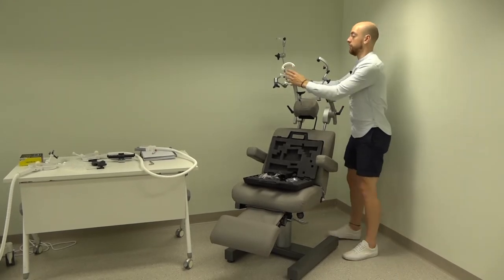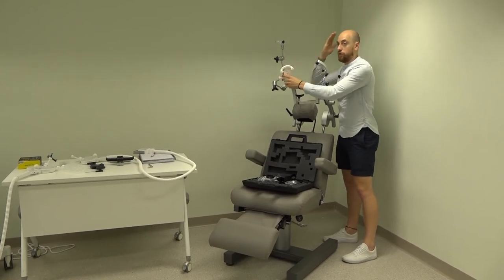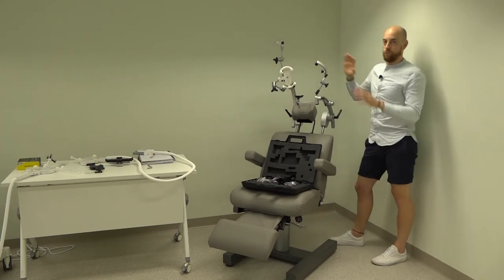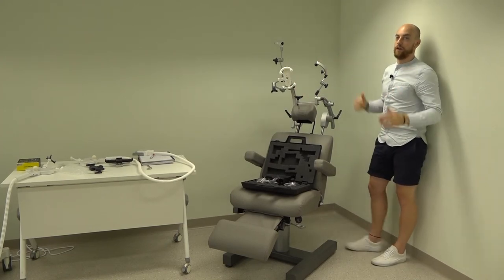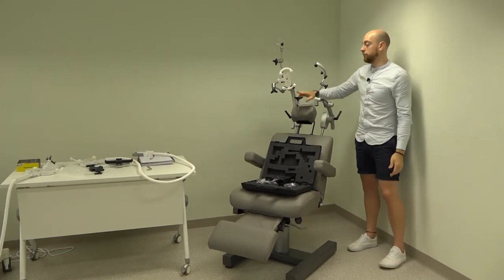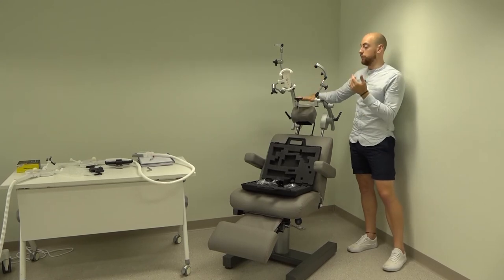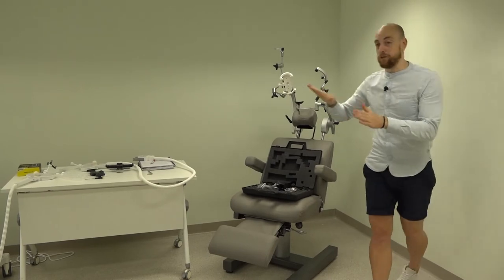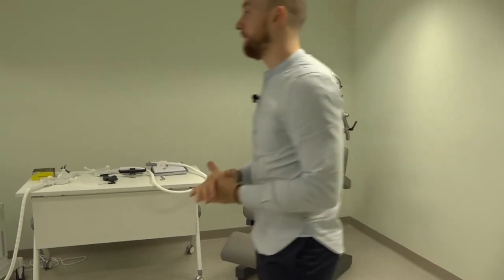So as long as we put this in the right place on the scalp, we can then stand away. Because everyone's nice and still, we've got our subject secured with the chin rest and the forehead rest, and that takes away the human error element.